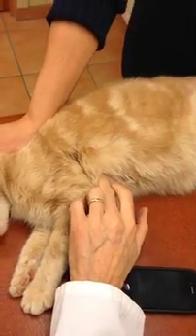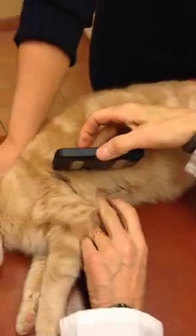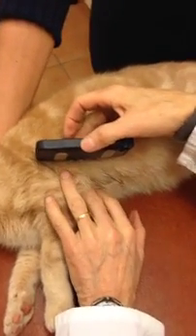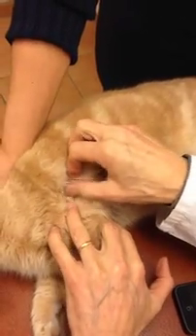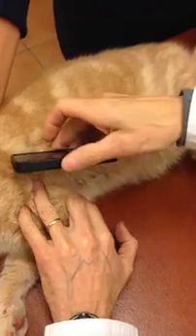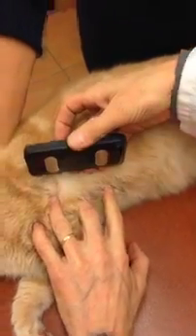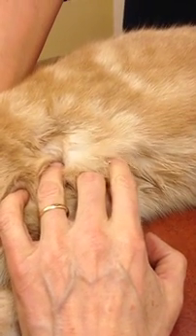As I found that, I will then place the telephone so I have the heart in the middle. At this point where the front electrode will be, I will divide the fur coat and put a few drops of alcohol on this side. Then I measure for the distal electrode here and place some alcohol here and divide the fur coat.